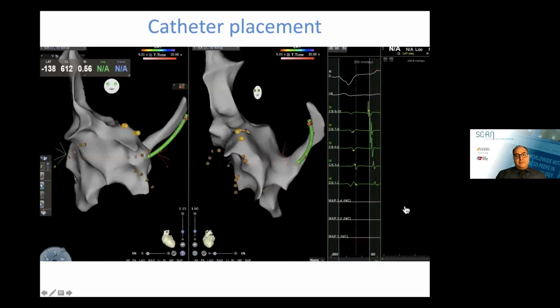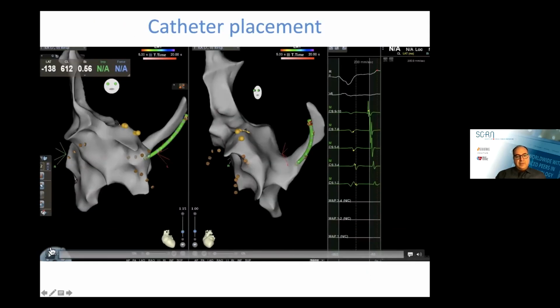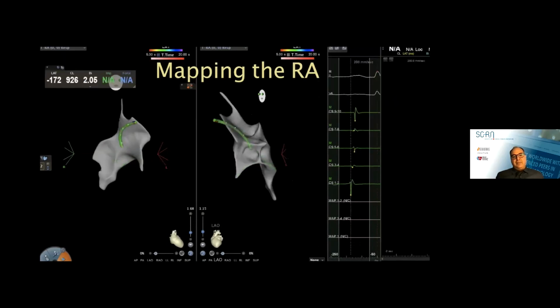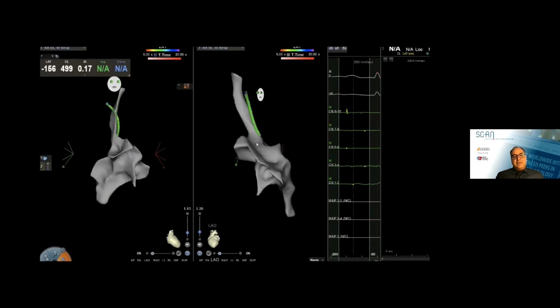So, answer to your question, what do you do if you don't have ICE? So I did that. Most people would not open an ICE catheter for a right-sided atrial tachycardia or SVT. So that's what we do. The sequence of events is the same. You get groin access, you use some sort of an ablation catheter where you can map. In this case, I'm using the Decanav again.